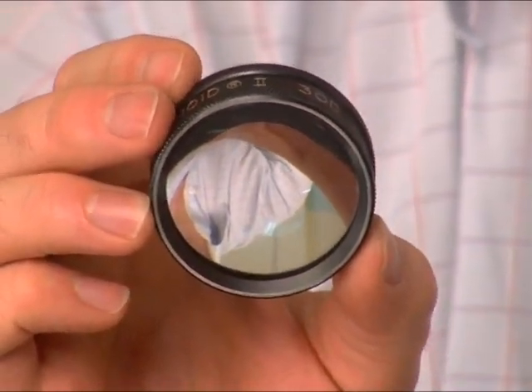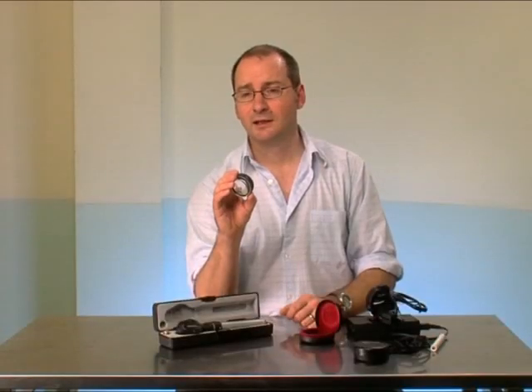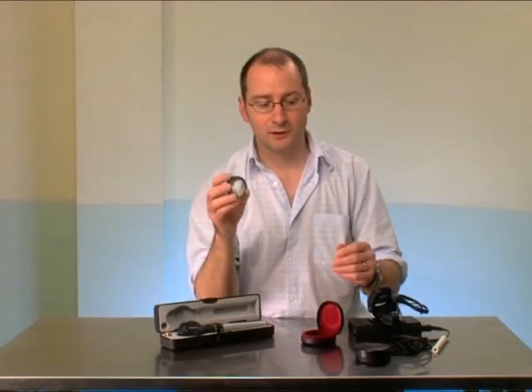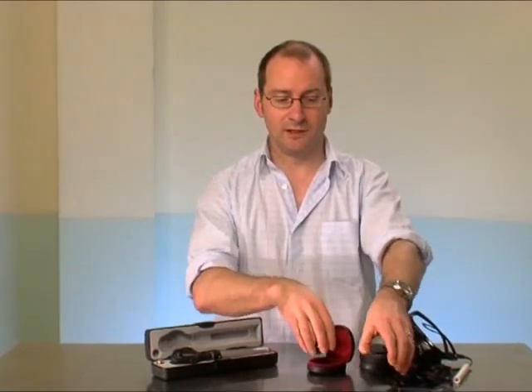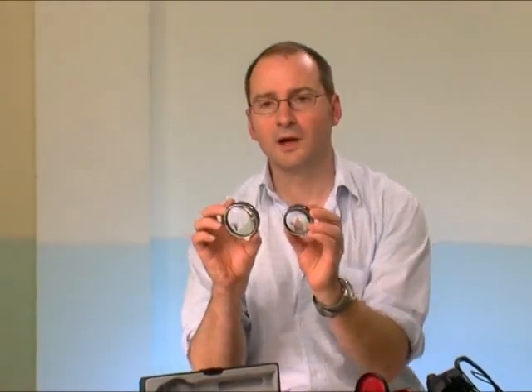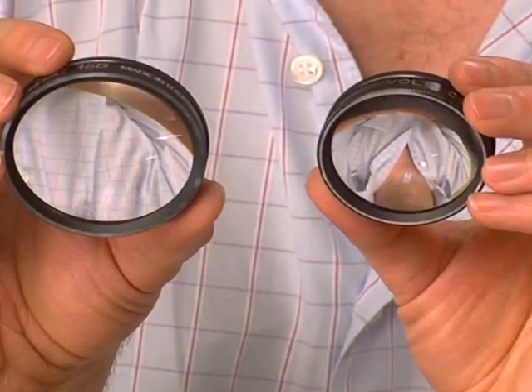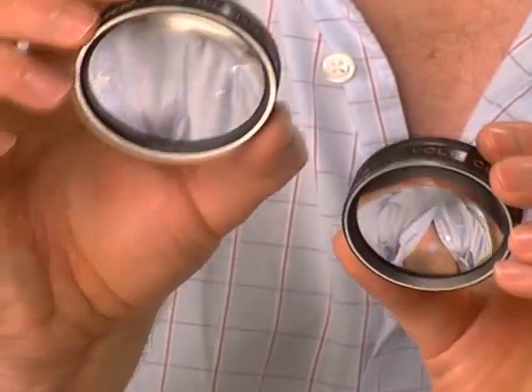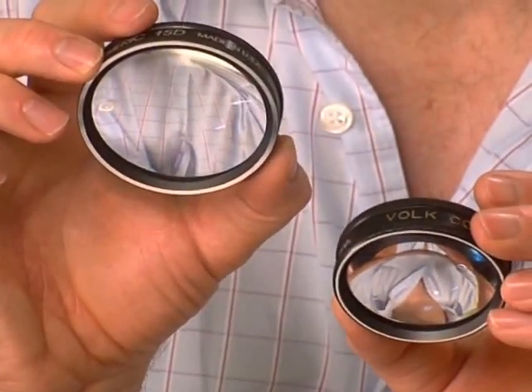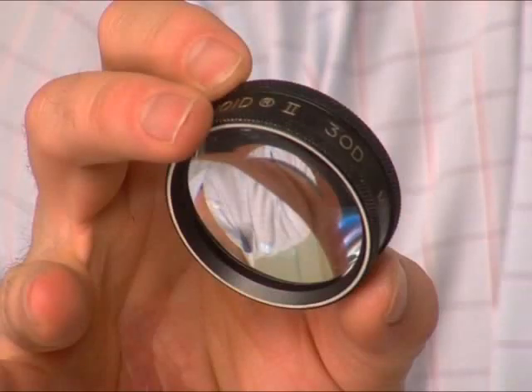Being a smaller lens, the focal distance from the eye is not as great as, for example, a large 15 diopter lens, whereby the focal distance from the eye is greater, and consequently it can be more difficult to stay in the correct plane of focus when you're using them. So I often would recommend a 30 diopter lens as a starting point.